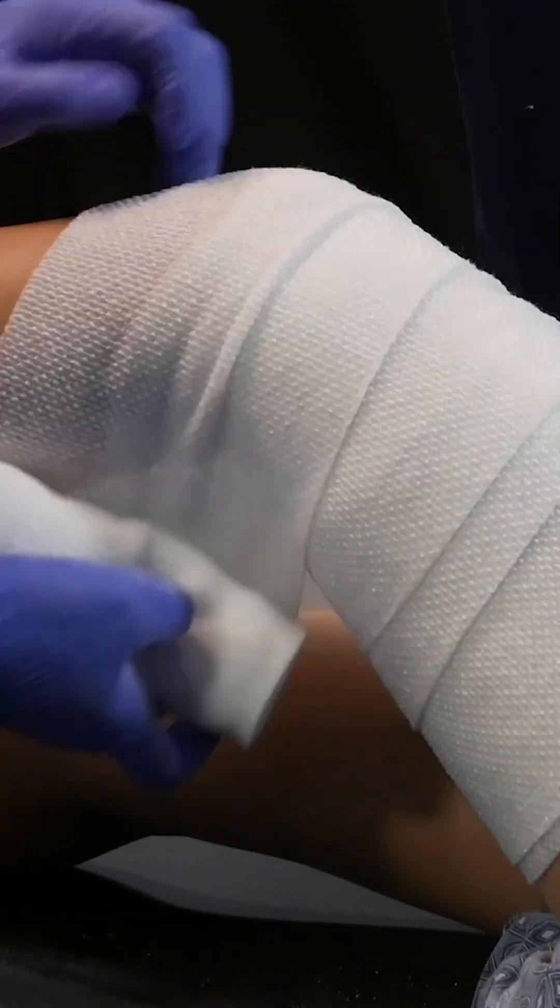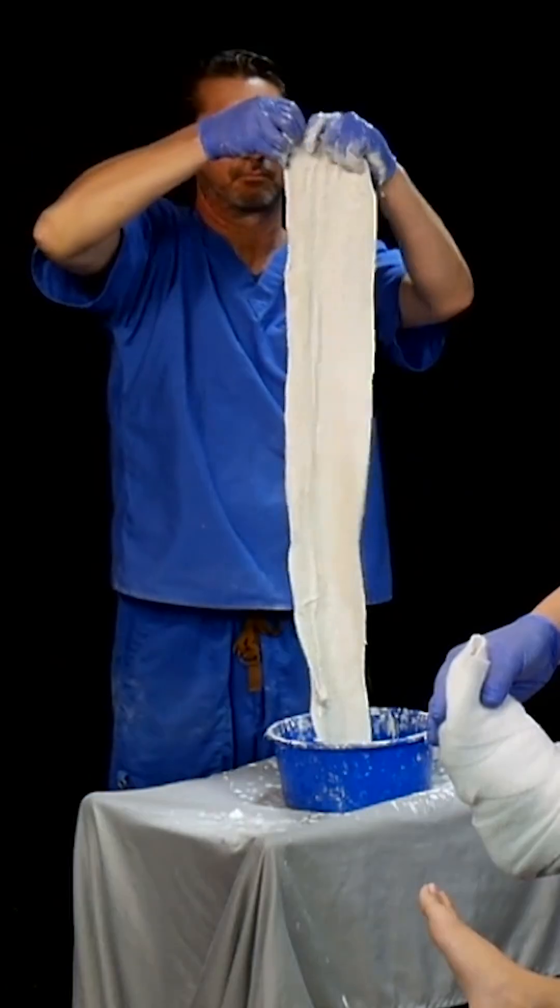Let's go ahead and wrap. For this splint, you're going to need 10 strips of plaster. He's dipping it into the water. The idea is forming 10 pieces of plaster into one piece of plaster.